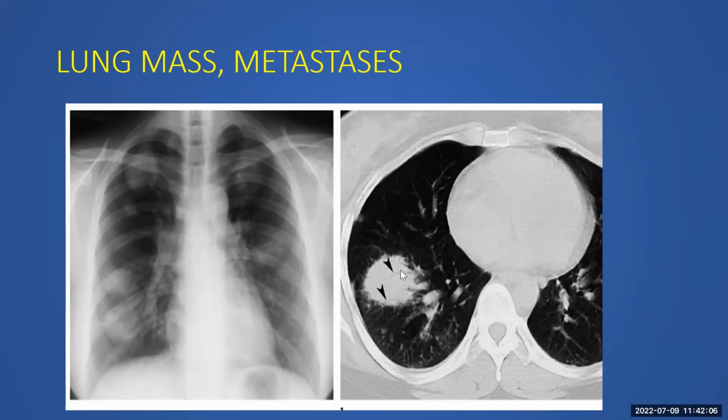But they just mentioned that in some of the sarcoidosis masses like these, you can get air bronchograms, which could be part of some infection. But this has been described in sarcoidosis also.